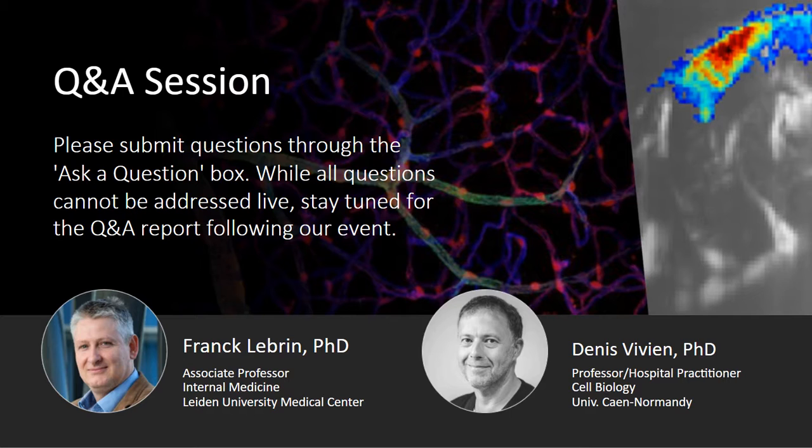So what I should add is that in the last 10, 15 years, all the preclinical investigations which have suggested treatments for stroke using these preclinical models failed when they were translated to the clinic. So we hope that by using models which are closer to the clinical situation, so the ones that I just mentioned with the in situ clot formation, and also relevant modalities of brain imaging, MR and fast ultrasound imaging, should help to make the preclinical investigation more relevant, with, we hope, successful translation to the clinical situation.